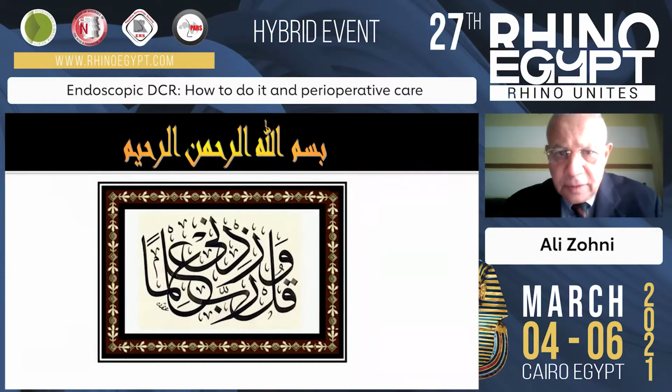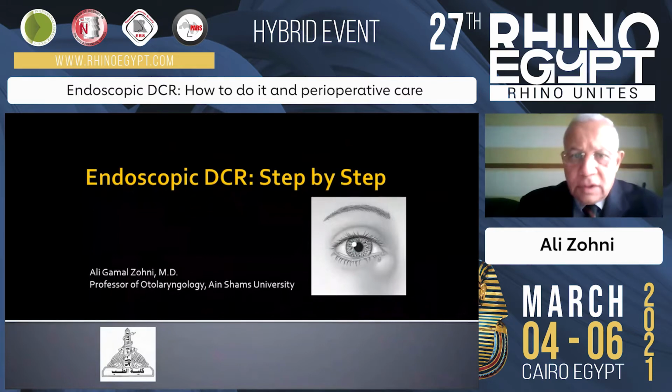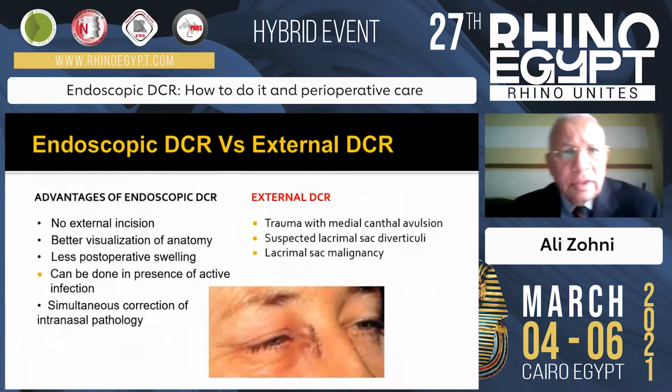Bismillah ar-Rahman ar-Rahim. In this presentation, I'm going to describe step by step a technique for endoscopic DCR. DCR in general can be done endoscopically, externally, or by laser.